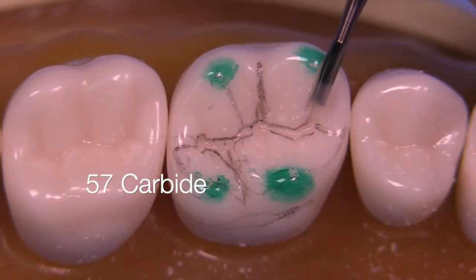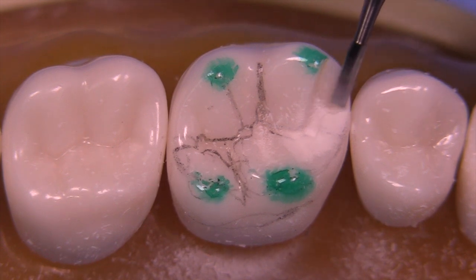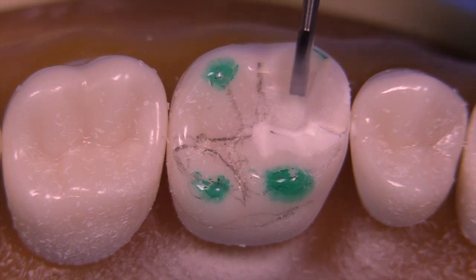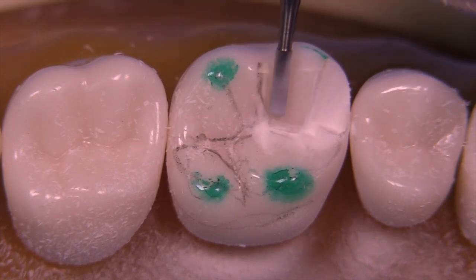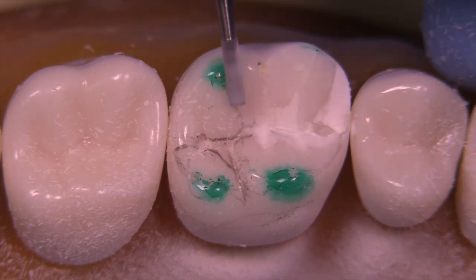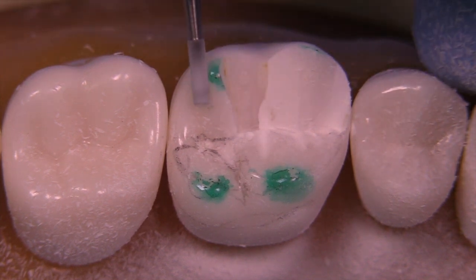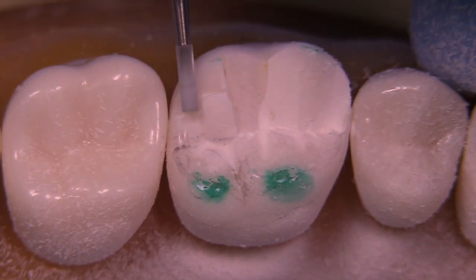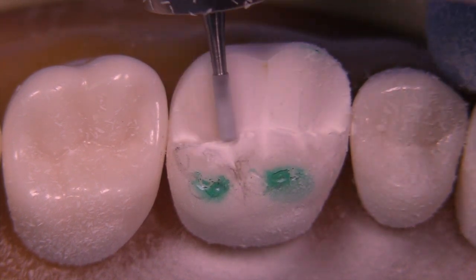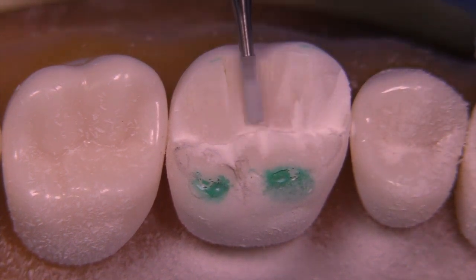Here's a short video to review the MOD onlay preparation for gold on a maxillary first molar. We're starting with the 57 burr, which is a carbide that measures one millimeter in diameter. You want approximately one millimeter of reduction on the non-functional cusp for an onlay, so it's more aesthetic and doesn't show gold when the patient smiles. You can use the diameter of the burr to judge how much you're reducing in this area.